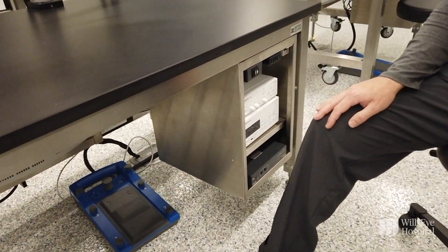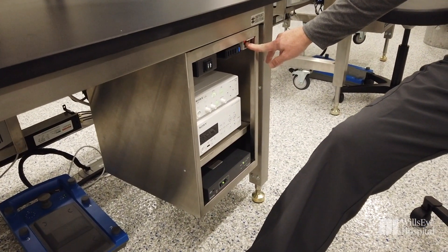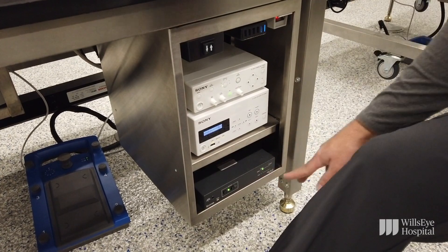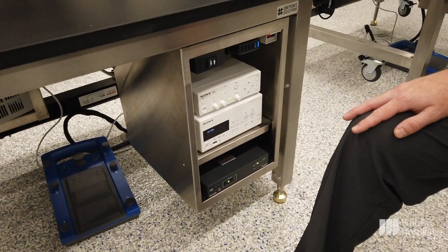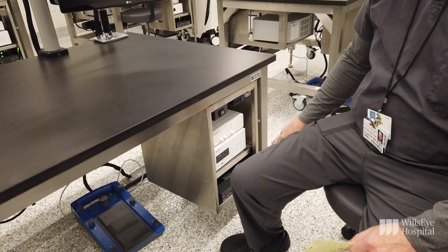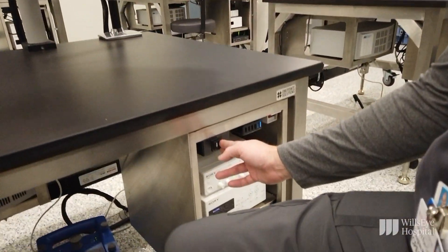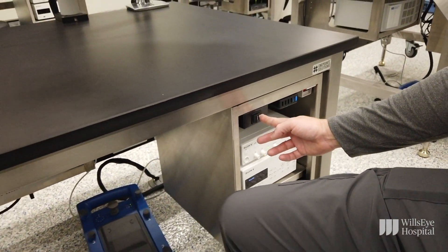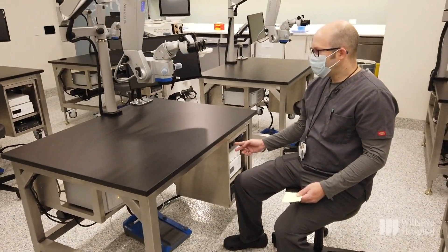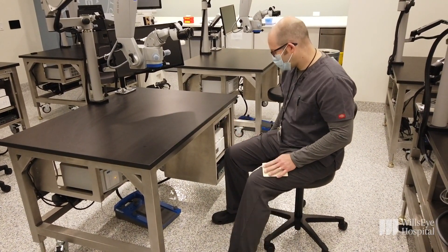Each station is fully adjustable and automated. There's a simple on/off switch in the upper right here. I will turn all the systems on except for the video recorder, which should be turned on manually — the image won't show up on the screen until the video recorder boots up completely. The system is set to raise and lower the table, adjustable to a person's body, so pushing the up button simply raises the entire table.